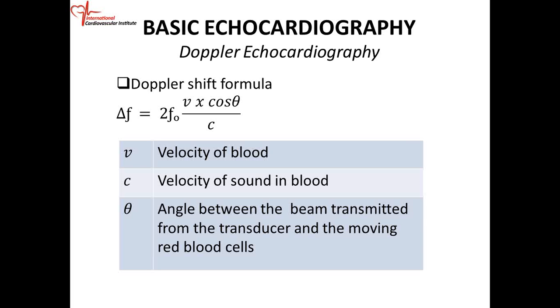Does that make sense? Because maximum Doppler shift, anything greater than that is going to give you a smaller number. Agree? So anything greater than cosine of 0? Yes. It's going to give you a smaller, less than 1. Less than 1, yeah. Okay. So the maximum Doppler shift is at 0 degrees.